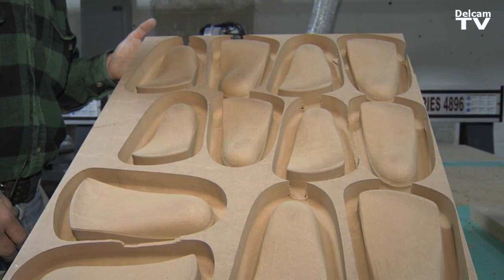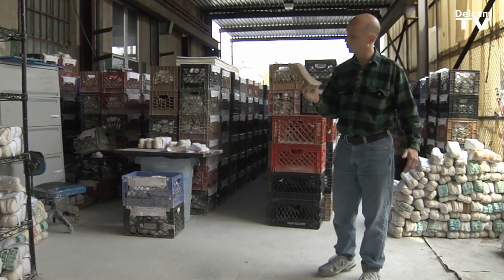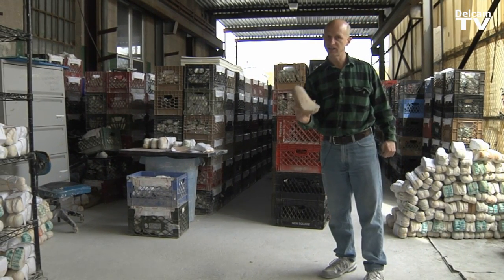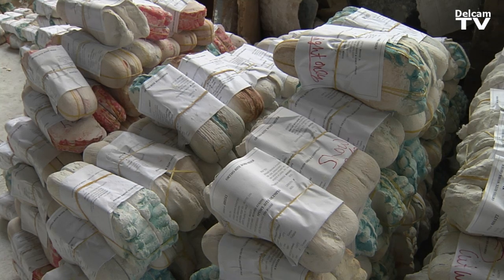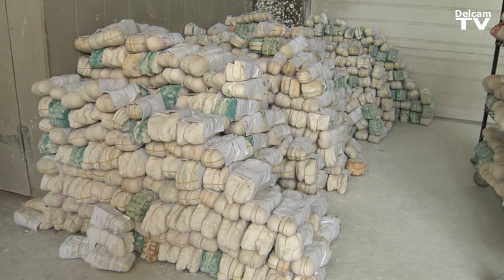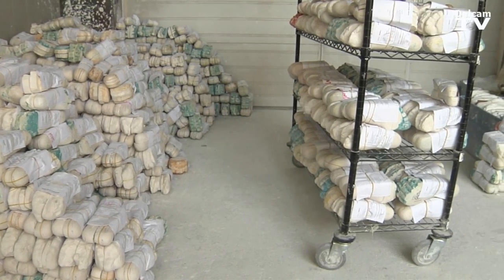This is what the DelCam OrthoMill program produces. The objective of using the OrthoMill program is to digitize this so we don't have that. All these casts can be eliminated and be digitally stored on a little hard drive, as opposed to using 3,000 square feet of space.